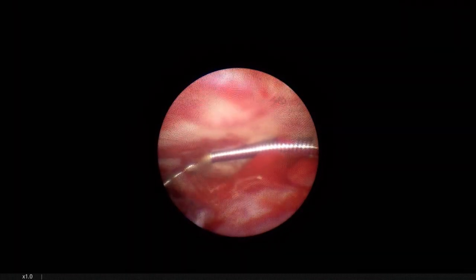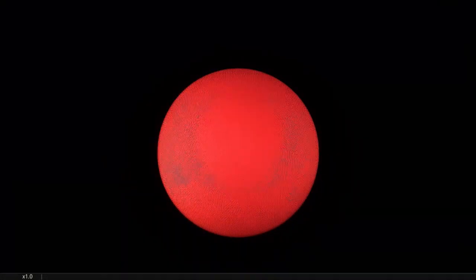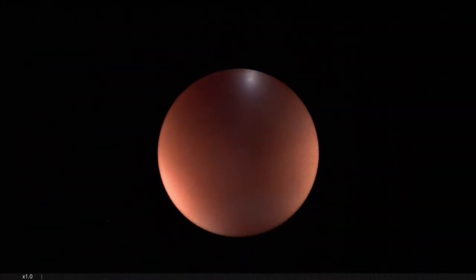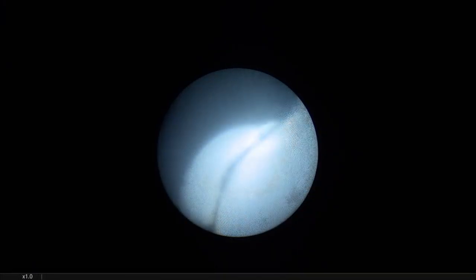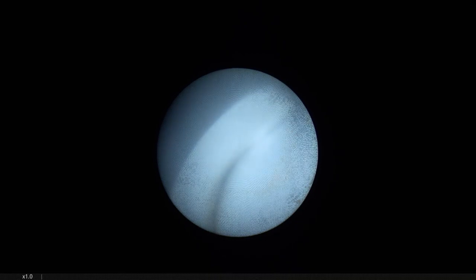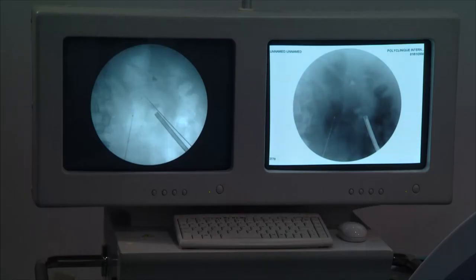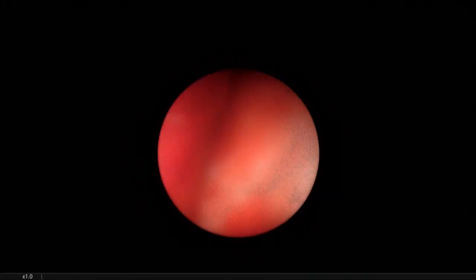When you had punctured the stone. No, we have... Did you see the endoscopic view? We saw where the entrance to the calyx is. Interesting situation. Because what we did is the second puncture. Yes, the other stone of course. And what we saw is where the guide wire comes into the calyceal system. You will follow it.